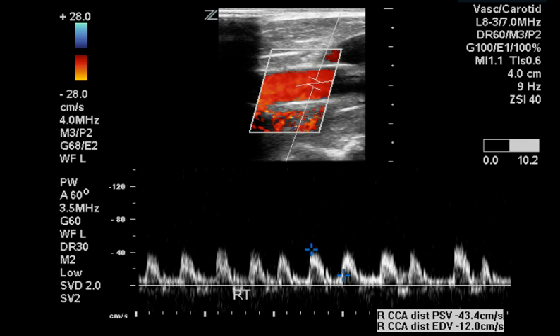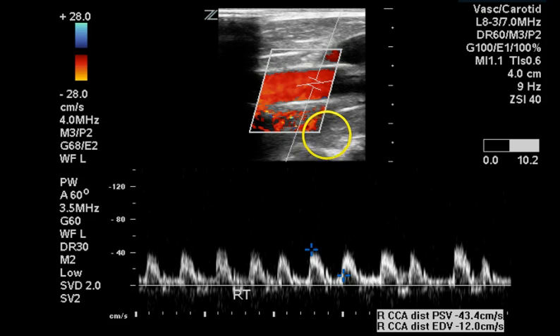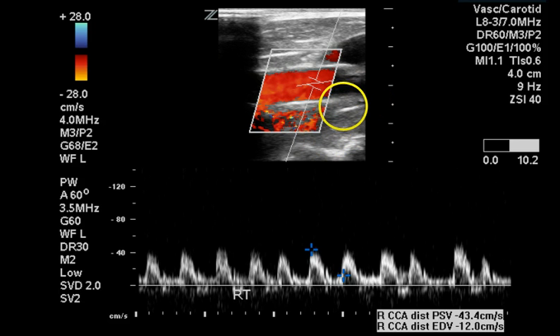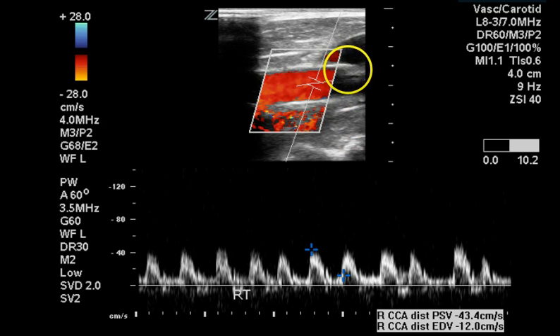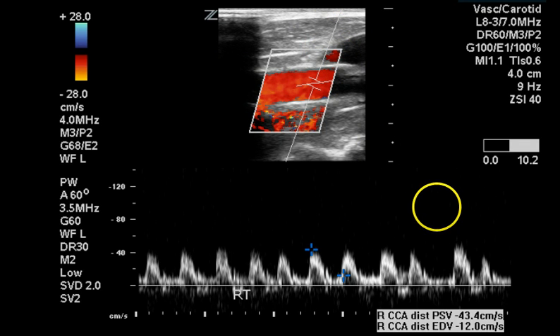This is the right distal common carotid artery. Surprisingly, what looked like plaque on earlier images is not seen here — the flow lumen is totally filled with moving color Doppler. What was identified erroneously as plaque on earlier grayscale images is probably reverberation from the skin or overlying muscle layers.